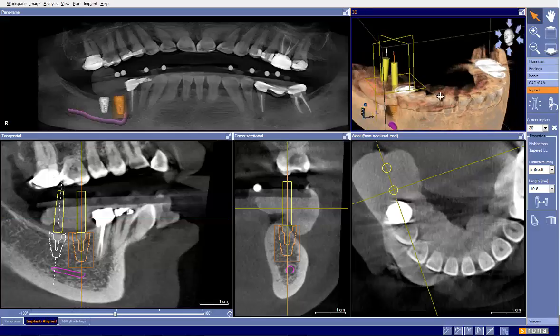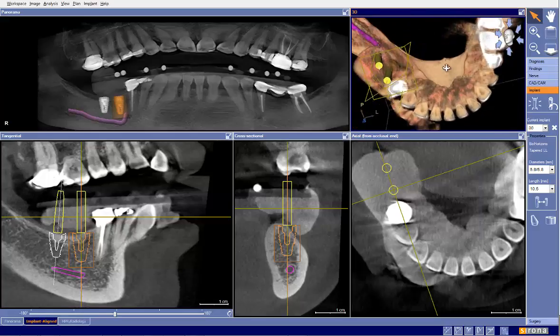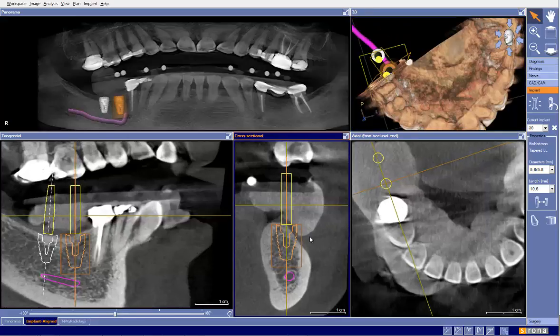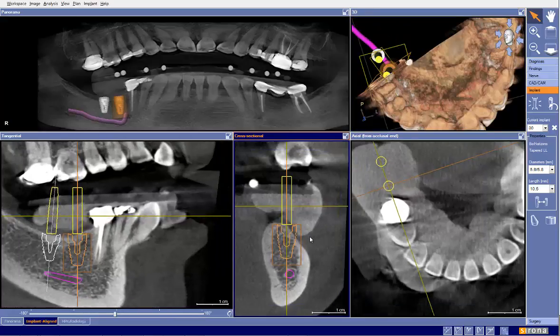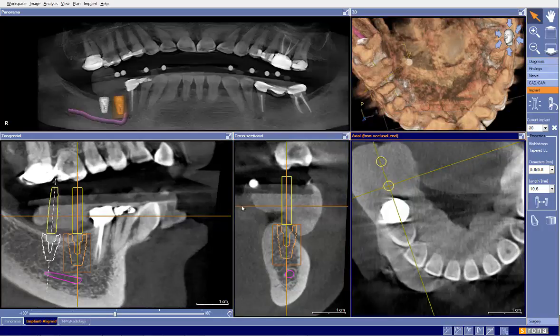I'm starting to like that quite a bit. So hopefully this has been helpful. This case definitely needs some grafting. I think compromising it any other way wouldn't be ideal here. So I would definitely graft this case. Again, with some training, this is a relatively straightforward case to do some grafting on. Thank you for submitting the case.